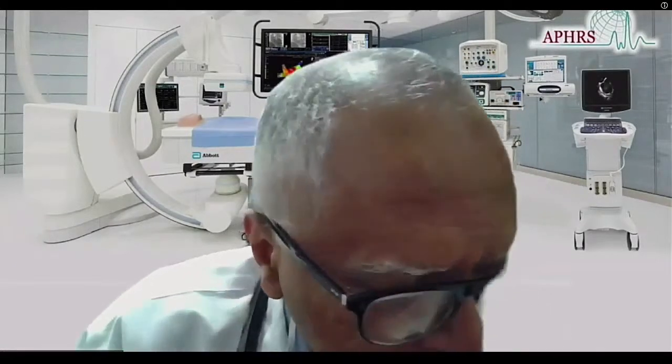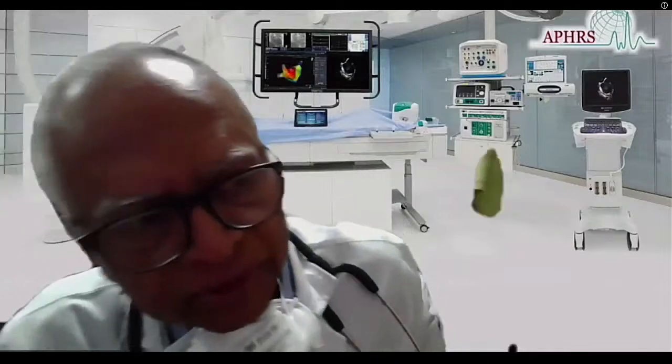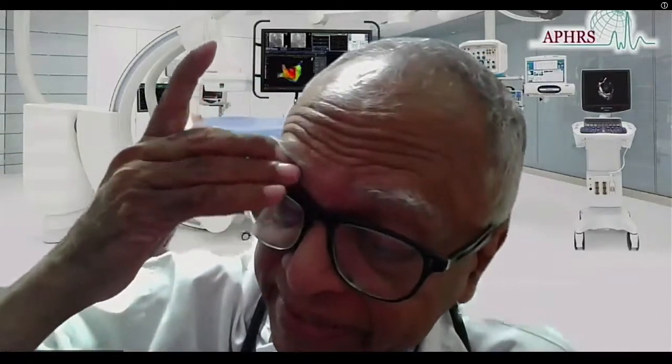One of the important things is do not start the first burn until you have mapped very well. The commonest reason is that once you burn the area extensively, you produce a lot of delayed atrial potentials, which will mimic the Mahaim potential. That's the problem in reablations of Mahaim. You'll get a very far-field, late-activated A, which will resemble a Mahaim potential.